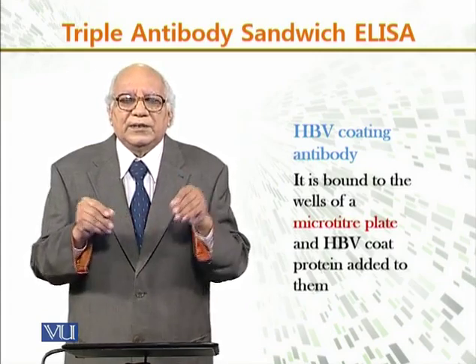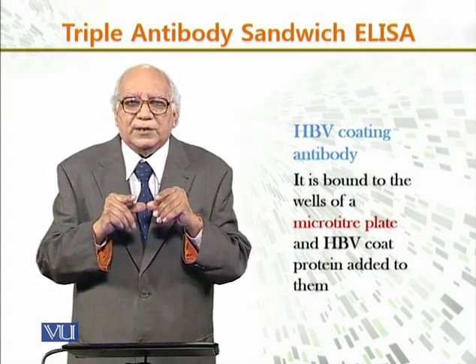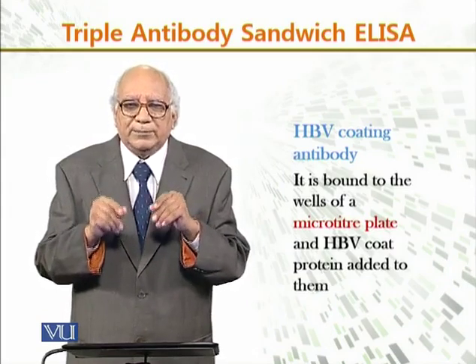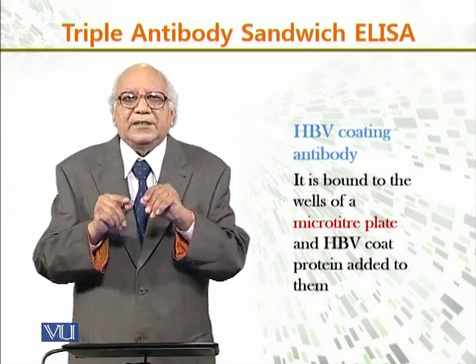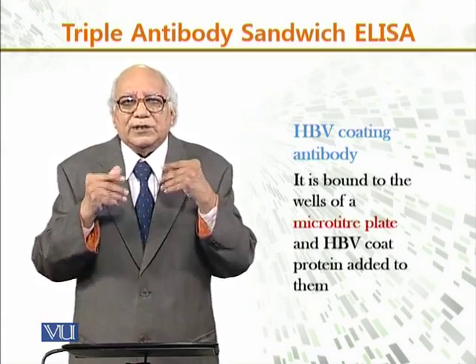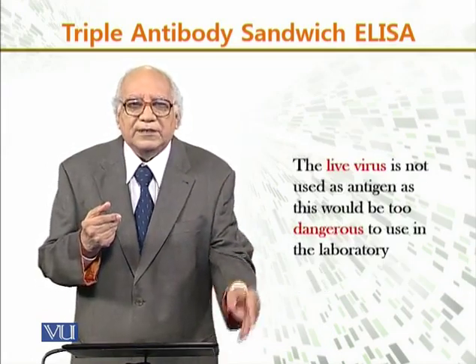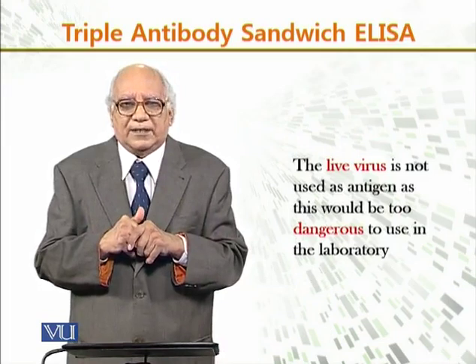So in the well of the microtitre plate, HBV coat protein is added, since we suspect there may be hepatitis B in the blood.